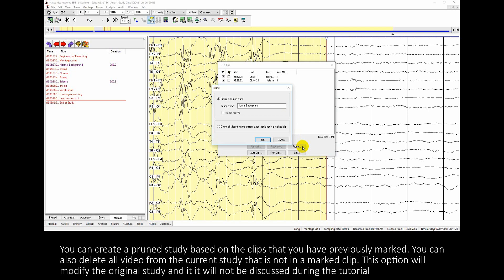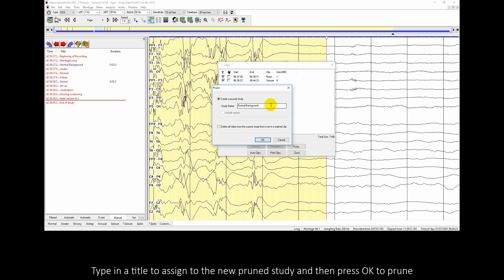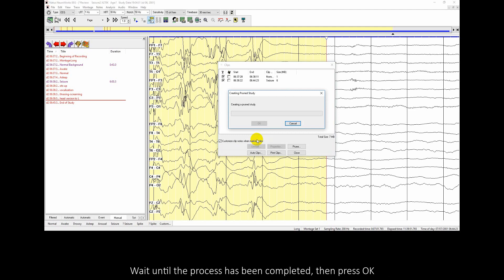You can create a prune study based on the clips that you have previously marked. You can also delete all video from the current study that is not in a marked clip — this option will modify the original study and will not be discussed during the tutorial. Select the first option, type in a title for the new prune study, and then press OK to prune. Wait until the process has been completed, then press OK.